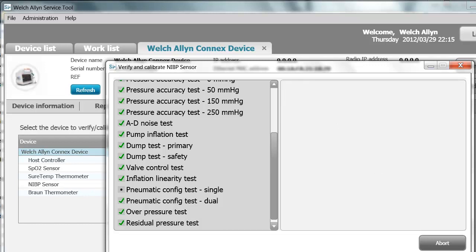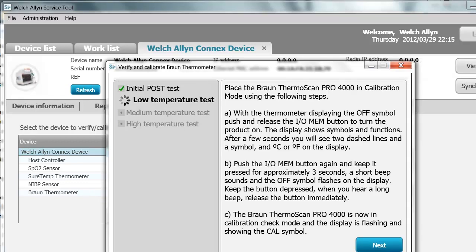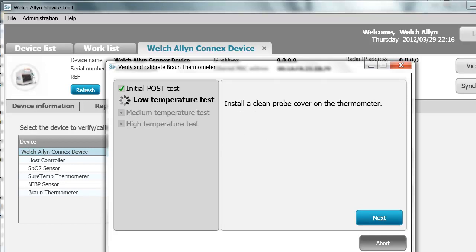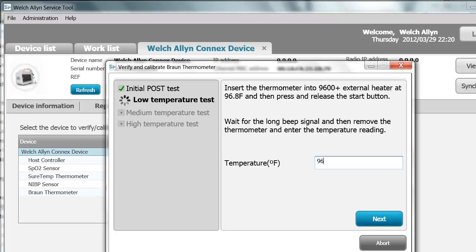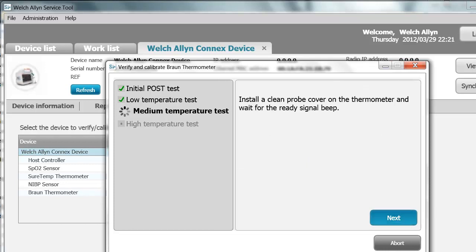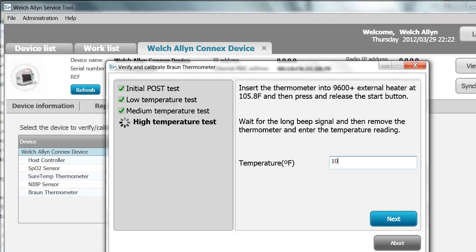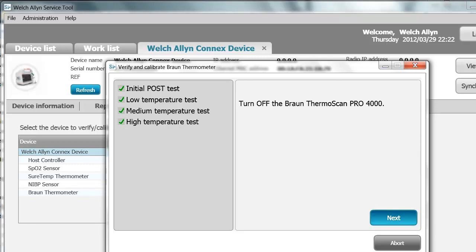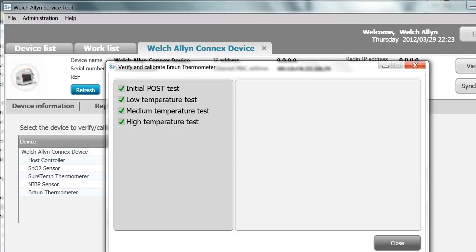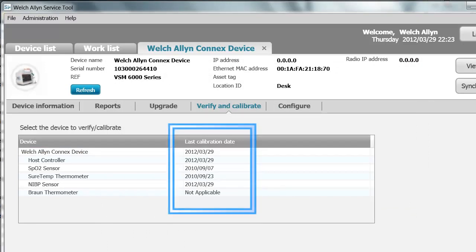As the NIBP test completes, go on to the Braun. Follow the on-screen instructions. Put the Braun thermometer into calibration mode. Read the value and enter the medium value, then enter the high value. Now turn off the Braun. As the test completes, the close button will appear. Pay attention to the last calibration date for the device — it changed for the device, the host controller, and the NIBP sensor. It did not change for the SPO2 sensor, SureTemp, or Braun thermometers, as those are only verification or functional checks. If one of these were out of specification, you would need to replace that module.